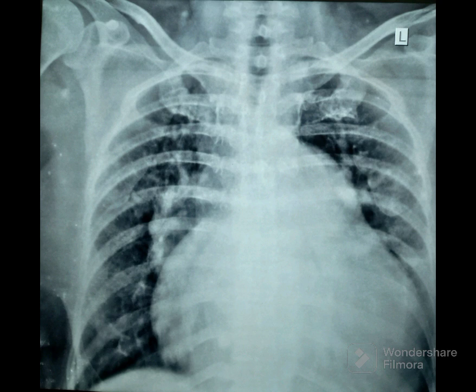Now let's explore further this chest x-ray to see if we can gather more insights. Focus on the left heart border. The topmost part of the left heart border is the aortic knuckle. In a normal chest x-ray, next to the aortic knuckle is a concave pulmonary bay made of the main pulmonary artery. Below the pulmonary bay is the left atrial appendage, and below that is the left ventricle, which makes up the major part of the left heart border.